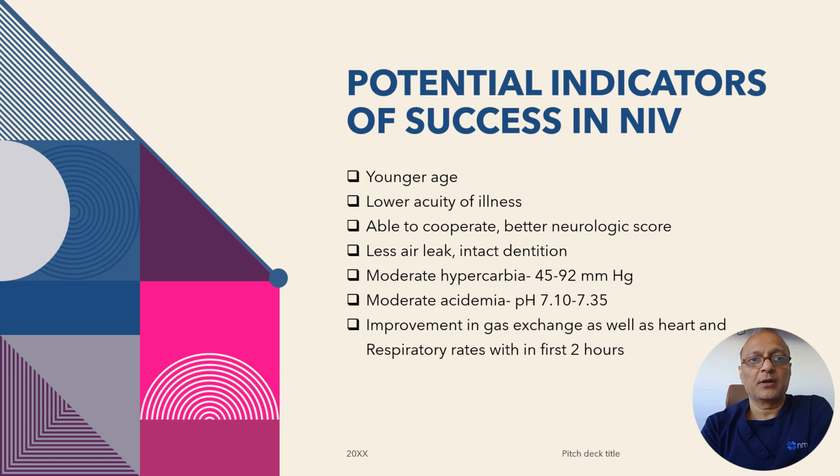Not all patients who meet the indication can be successfully managed with NIV. The potential indicators of success with NIV include younger age of patient, less acuity of illness, better mental status, less air leak, ability of patient to cooperate, and when the patient's clinical condition and gas exchange improvement occurs within the first 2 hours of its application. These are by no means hard criteria but provide reasonable value to predict potential for success of NIV.